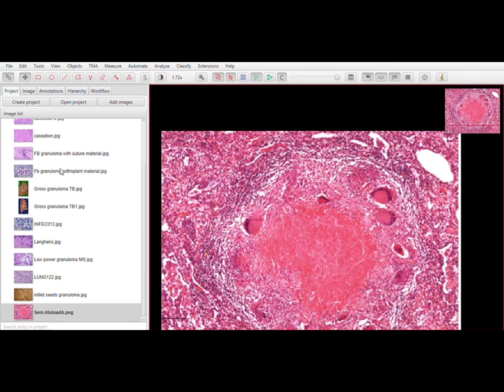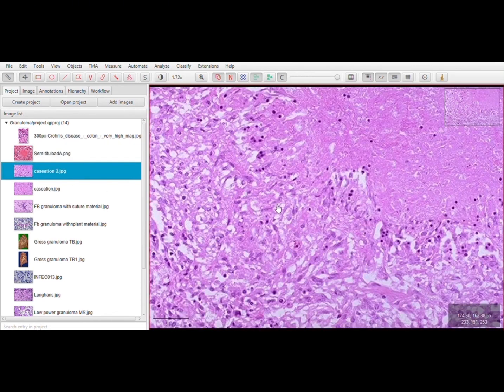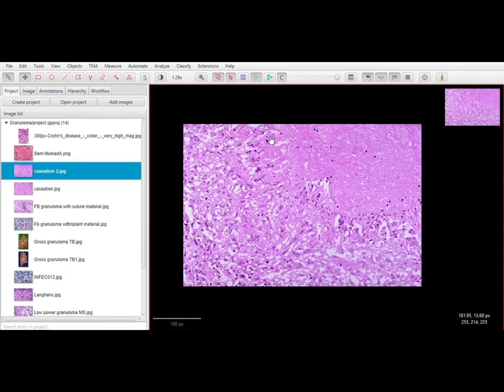For another tuberculous granuloma, I can show you this slide, which may give you a different view. This is again another granuloma which has caseation necrosis in the center, with some dashes of these purple dots which are elongated cells.